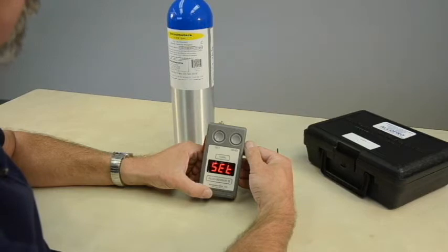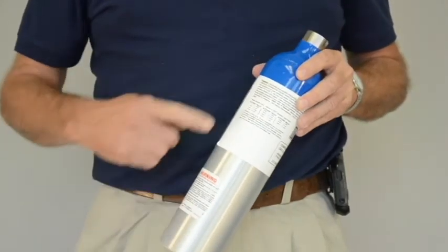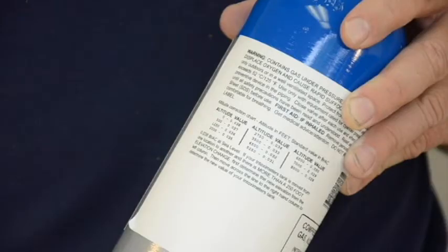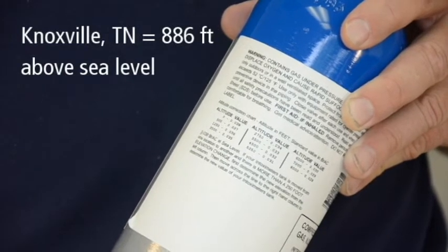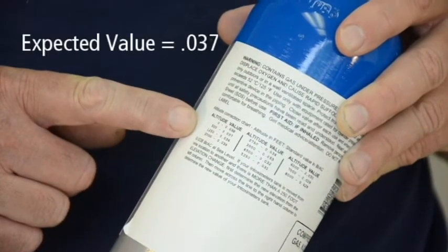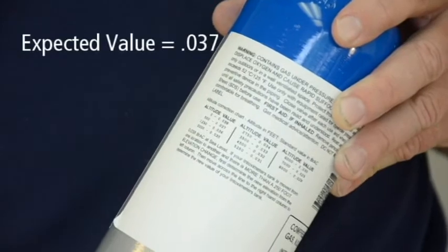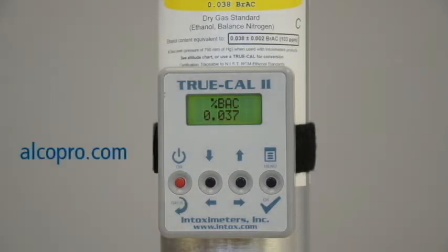Before performing a calibration, you must first locate the expected value of your gas standard. The expected or target value of your gas standard can be derived by referencing the altitude chart on the back of your tank. For example, if you are performing a calibration in Knoxville, Tennessee, which has an altitude of 886 feet above sea level, the altitude chart shows the expected value of the alcohol gas tank to be .037. You can also derive the expected value by using a TruCal device, which uses atmospheric pressure to predict the expected value of the gas. You can purchase a TruCal device at alcopro.com.